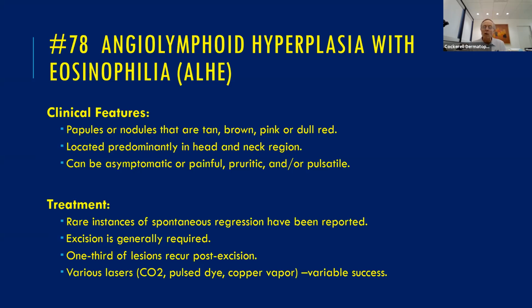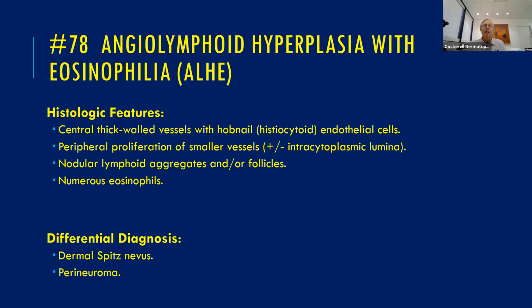It's kind of controversial as to what this disease actually is. Some people think it's a reactive inflammatory process with blood vessels. Other people think it's a vascular malformation with a pseudolymphomatous reaction. This depends on which side of the border you like to be on. But the main thing is for you, just make sure you know how to diagnose it. Now, I'm sure, especially you third years on the session today, know what the classic histologic differential diagnosis of this is, and it's not this.